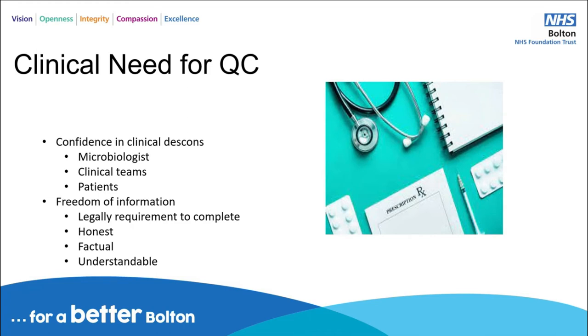The patients want to know that the tests being performed on their samples are of the highest quality and the highest standard and give the right and accurate results. And we have all had experiences where there is a query around a sample that's very close to the cutoff. Once you get an issue around a really good test, once it's questioning whether it's the right test or how sensitive and specific it is, it's very difficult to get microbiologists and clinical teams to become confident in that test and that procedure again. Any kind of issues around results, if it doesn't match the clinical picture, can be very difficult to come back from. It creates an air of misunderstanding and mistrust.